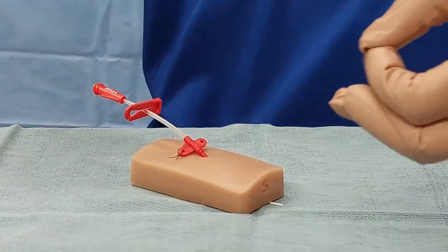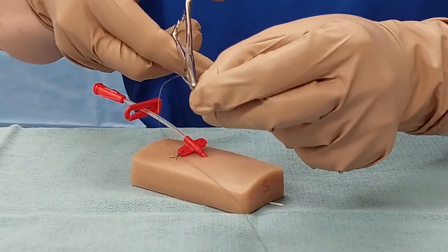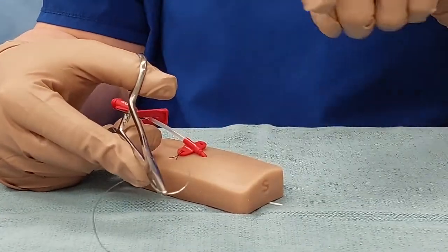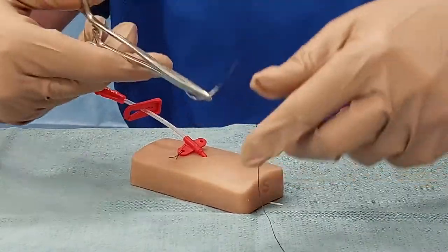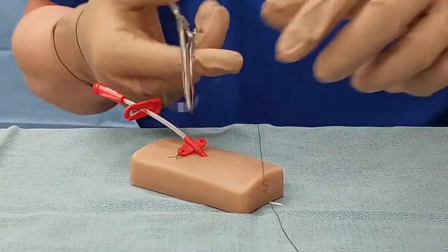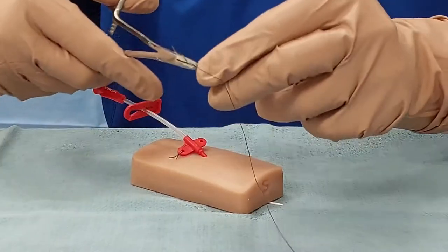We're going to get ready and do the other one, so I'm going to load my needle again. One trick: make sure the needle is pointing in the same direction as your thumb so that it's not backwards. Because if it's pointing the wrong way, you have to do a super awkward turn. I always have my needle pointing towards my thumb.